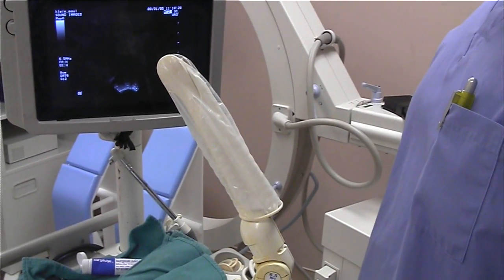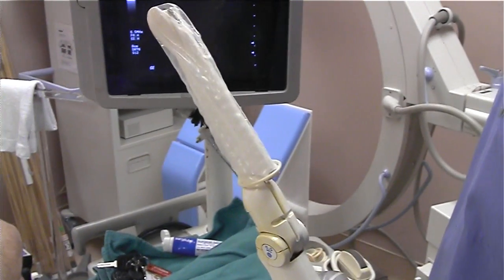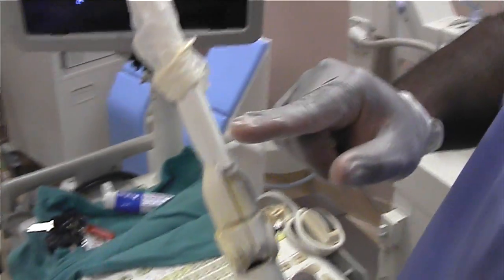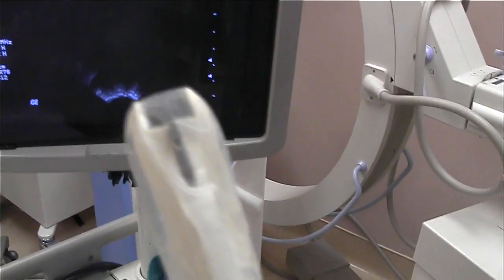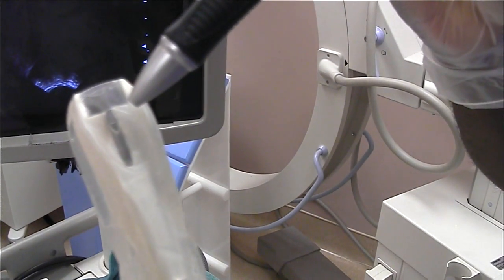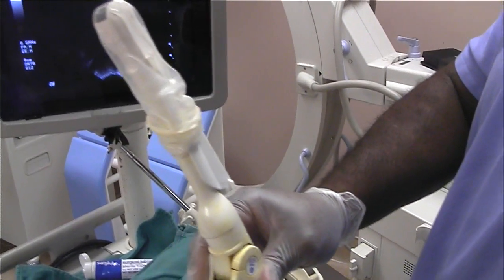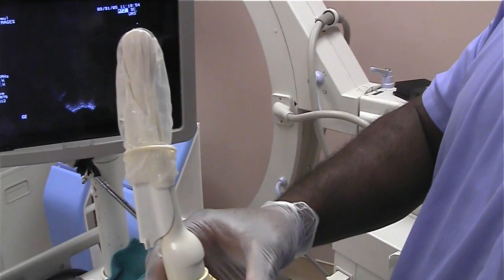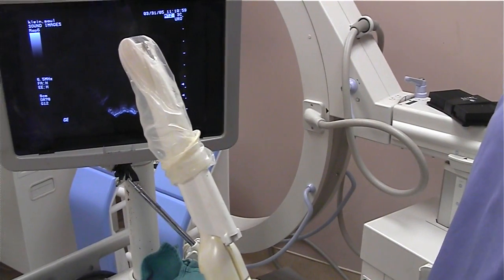This is the needle insertion probe and if you can just rotate it, MJ, to show us where the needle actually goes in. The needle guide is piggyback, and the needle actually comes out here at this point. So that's the probe in its entirety. There's a special name for this probe — this is the GE Logic II biplanar probe.